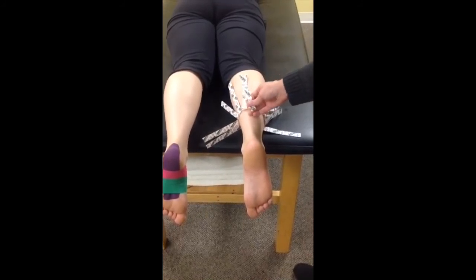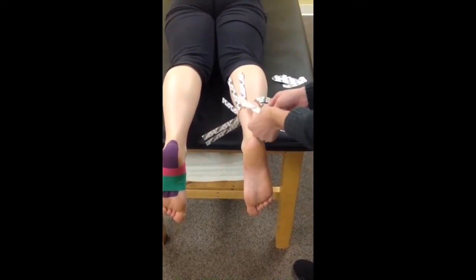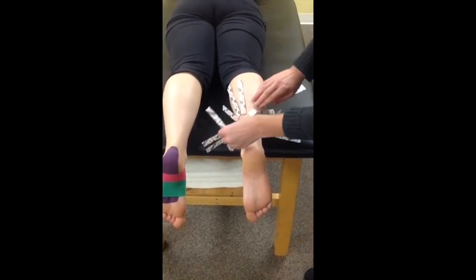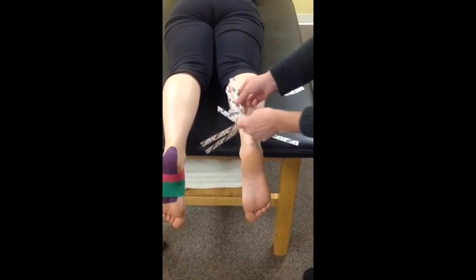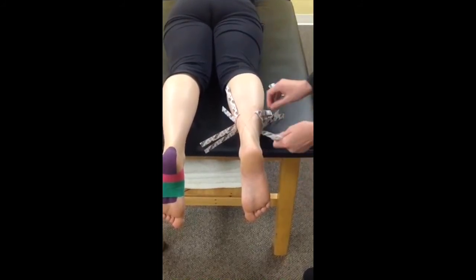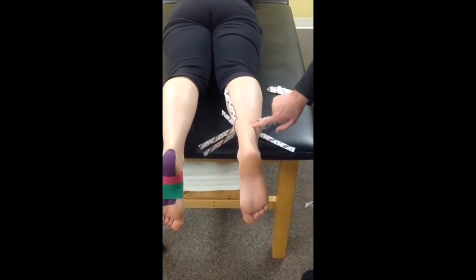You don't want to stretch this tape at all. You start from the inside here and you're just going to alternate side to side. So we're going to come across like this and then we're going to go across like that, and then we're going to continue. You want to try and get these strands nice and close to each other.